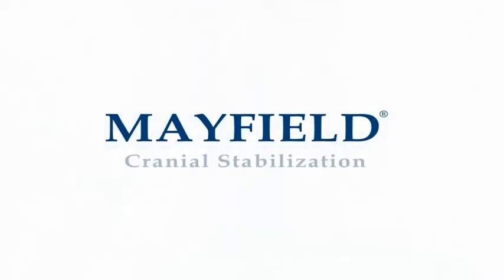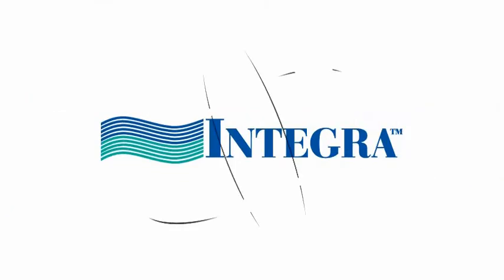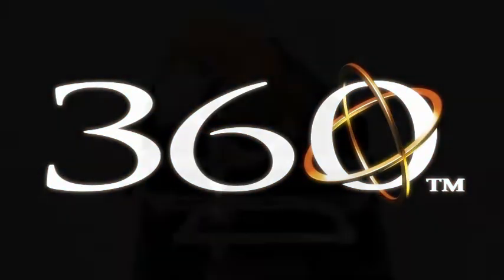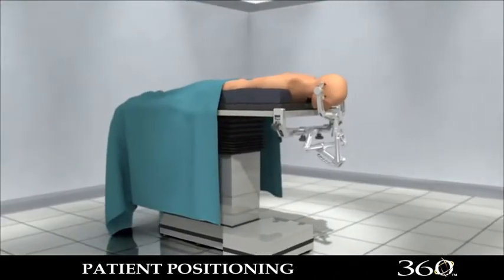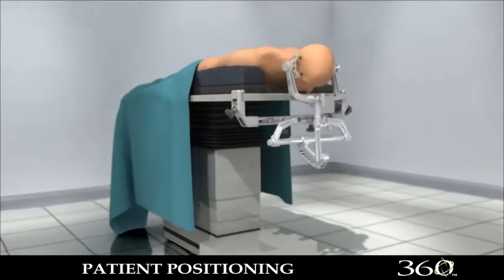Introducing the next generation of Mayfield Cranial Stabilization Equipment from Integra Life Sciences Corporation: the Mayfield Ultra 360 Patient Positioning System. Patient positioning is important in neurosurgical procedures, and for the past 38 years, neurosurgeons have relied on Mayfield to support and stabilize their patients.